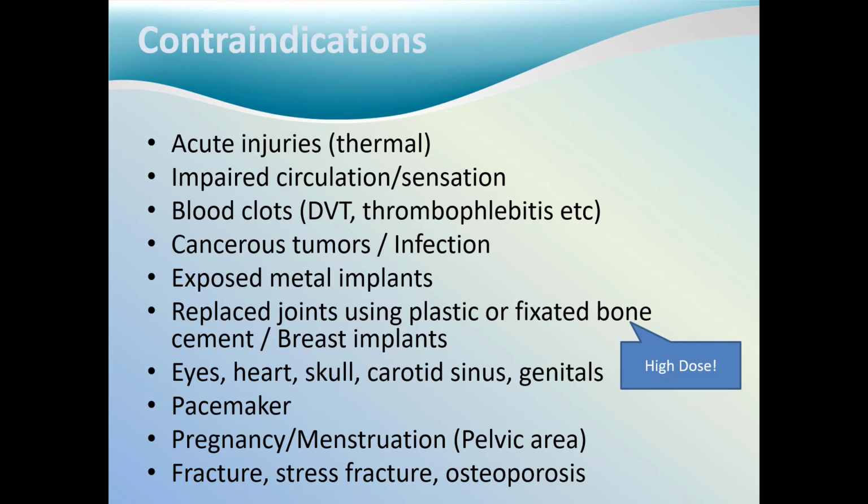You will most likely know the patient's reaction immediately when applying the ultrasound treatment if there is a fracture. The acoustical microstreaming and cavitation will result in an oscillation, which will move the bone fragments and will result in a substantial amount of pain.